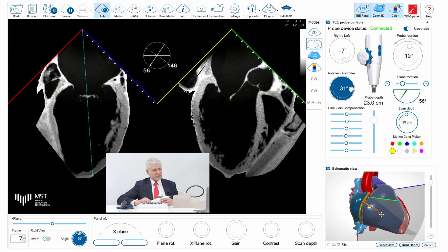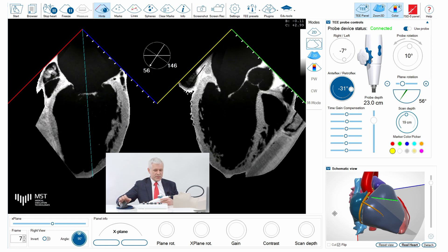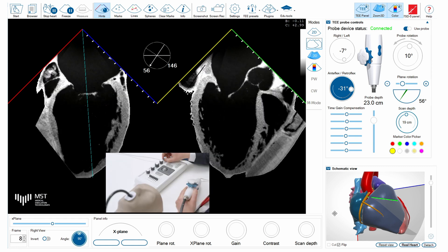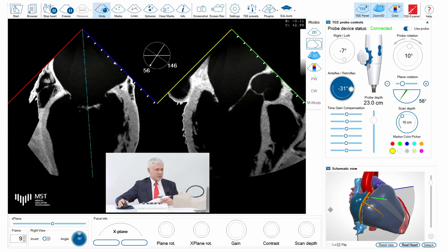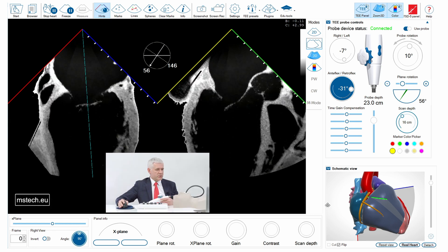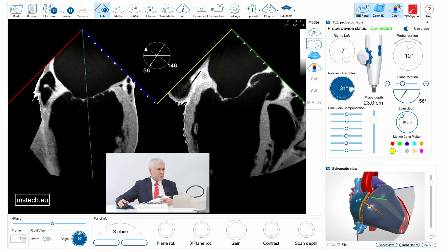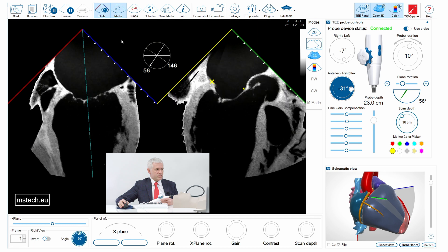When scanning the mitral valve it is very important to understand the on-axis images that can then help understand the pathology and also be very useful during the structural heart intervention.